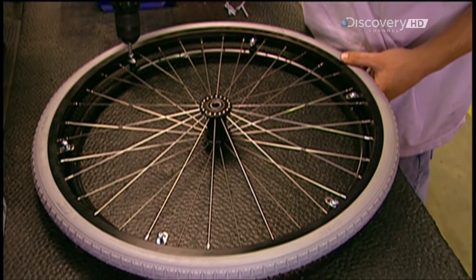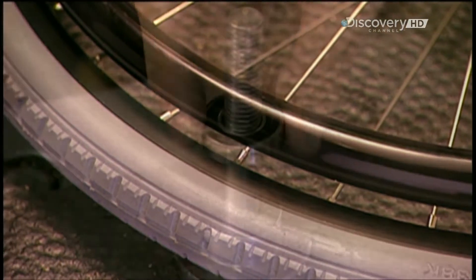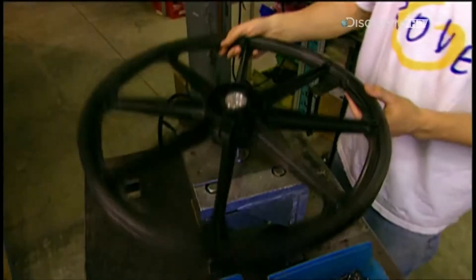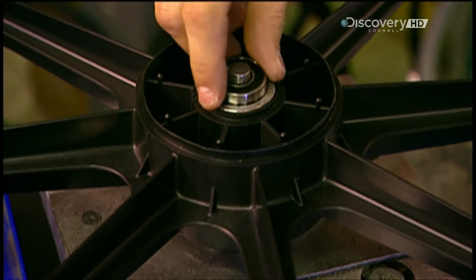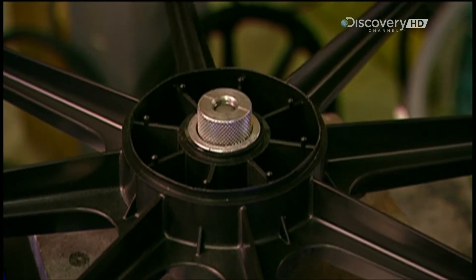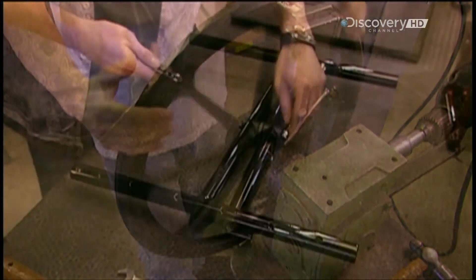Workers join them with industrial strength four centimetre steel screws. You buy replacement parts, much like you do car parts, through specialised dealerships. Bearings make the wheels roll with ease. Installing them is a delicate operation — workers use special custom tooling to insert the bearings with extreme precision. The tyres are rigid and have no treads, because they're designed for smooth, indoor surfaces.